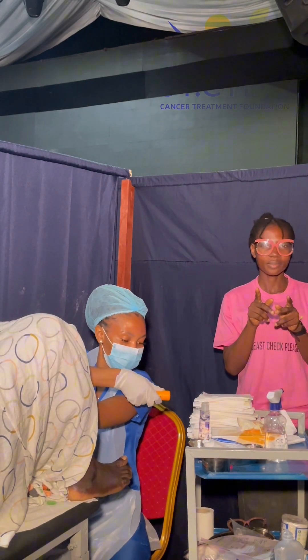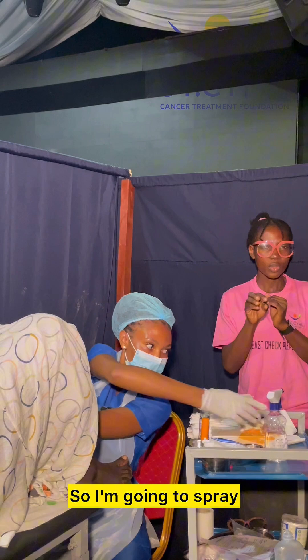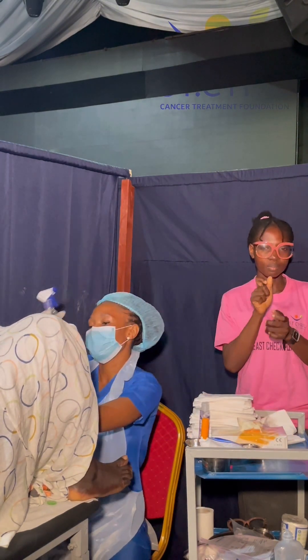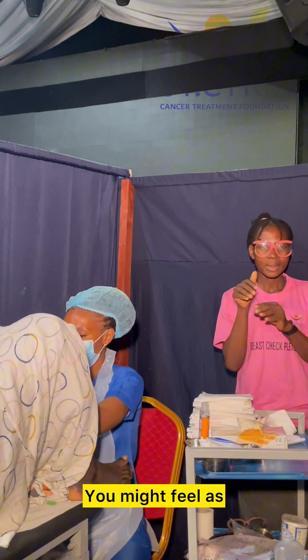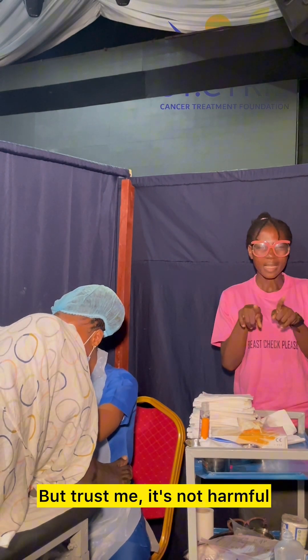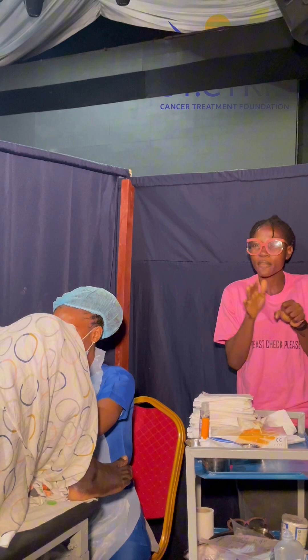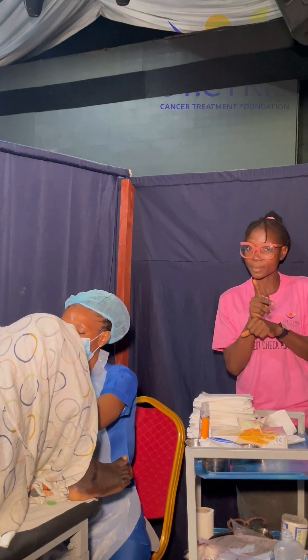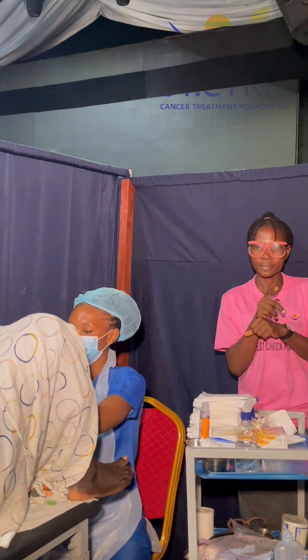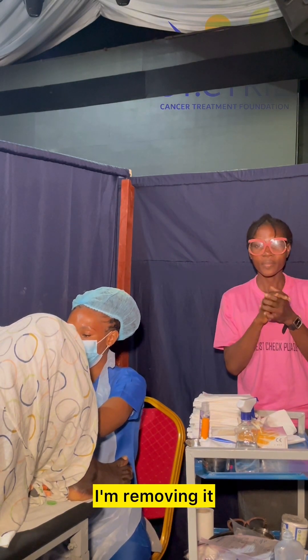Okay, I'm there. So I'm going to spray the acetic acid. You might feel as if there's water inside your vagina, but trust me, it's not harmful. Okay, I'm removing it.